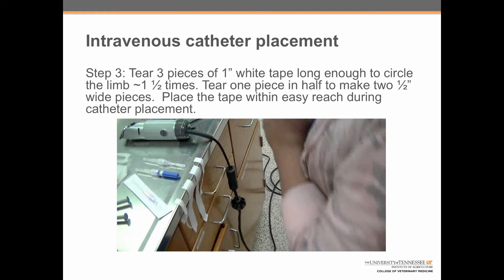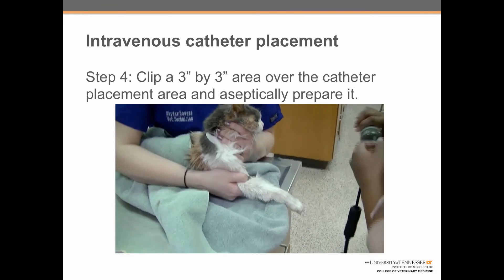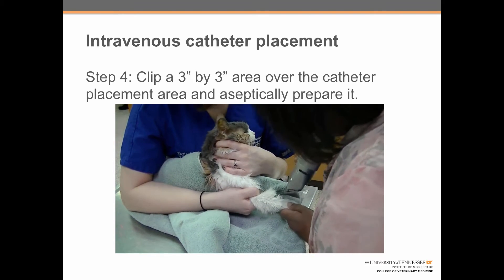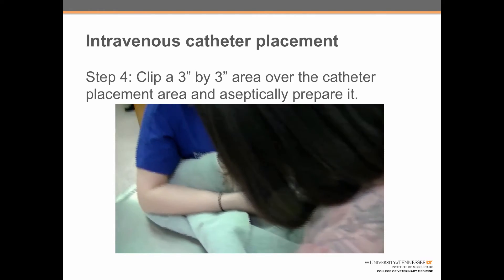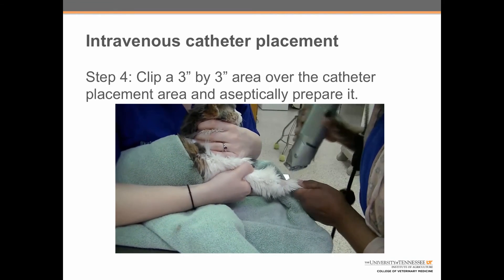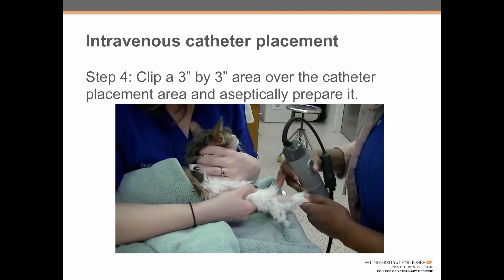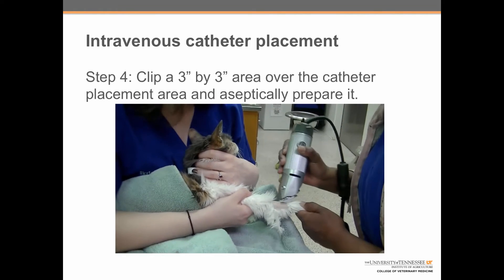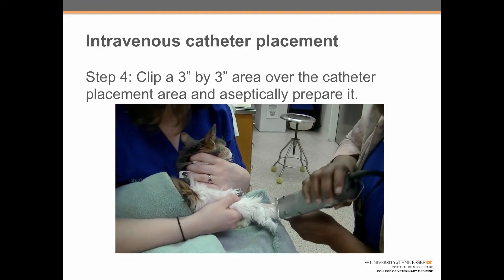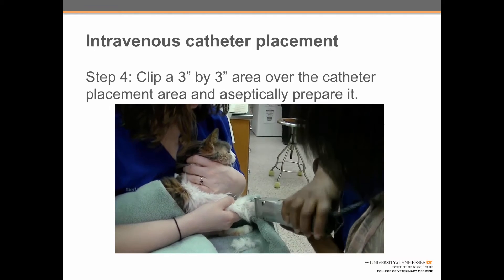Step 4: clip a three-inch by three-inch area over the catheter placement site and aseptically prepare it. Here we can see Shanna turn the clippers on. She took the clippers away from the cat when she started them so they wouldn't be frightening, and then brought them back in to clip thoroughly. It is very important that you clip a full three-by-three-inch area on top of the limb. Some people also clip around the back side of the limb to prevent hair from interfering with the tape, though clipping the front and top thoroughly is essential.